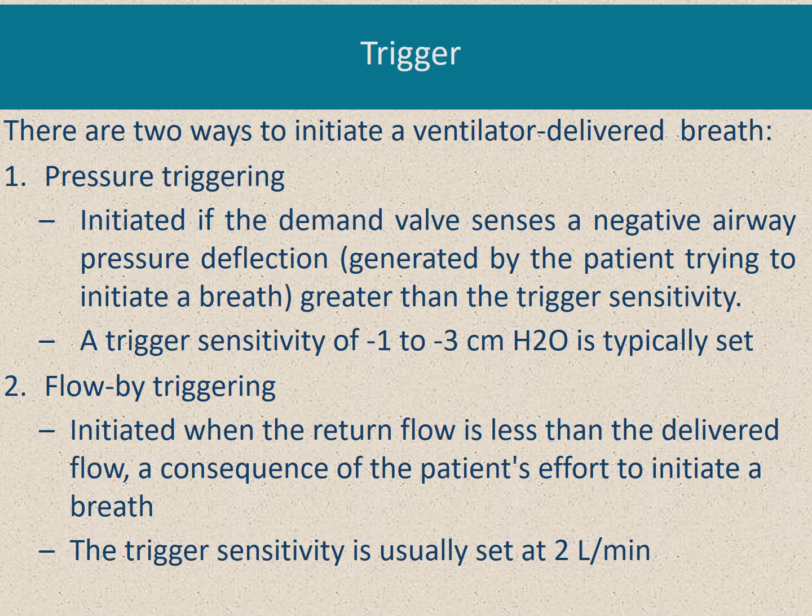In flow triggering, it is initiated when the return flow is less than the delivered flow, a consequence of the patient's effort to initiate a breath. The trigger sensitivity is usually set at 2 liters per minute.